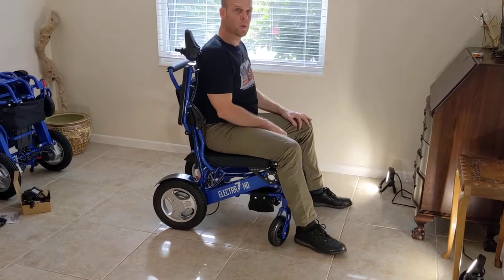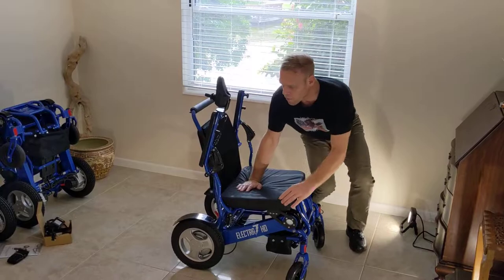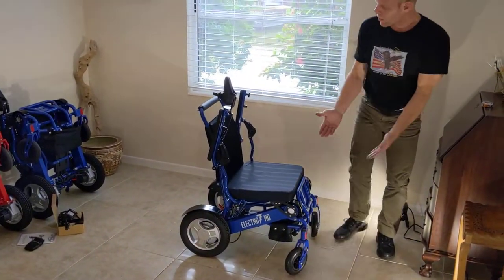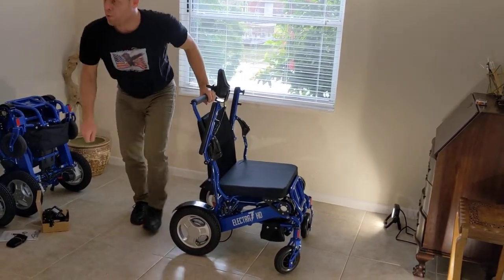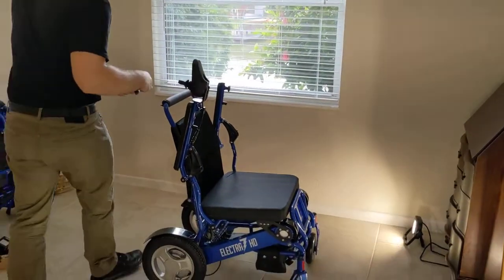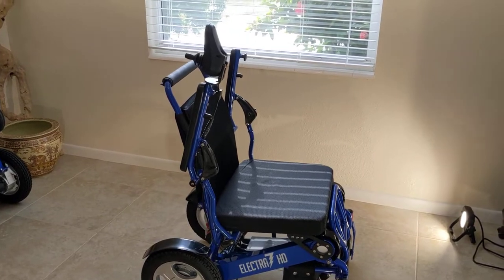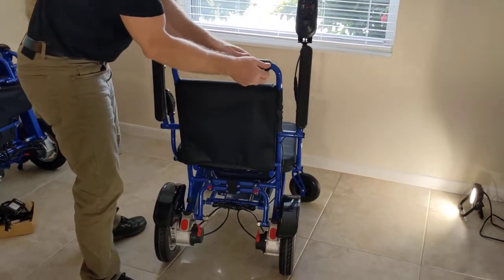Both armrests easily lift up, giving you plenty of options for transfers in and out of either side of the chair. With an accessory called the attendant controller bracket, you also have the ability to mount the joystick on the back of the chair for caregiver use — we've made separate videos about that.